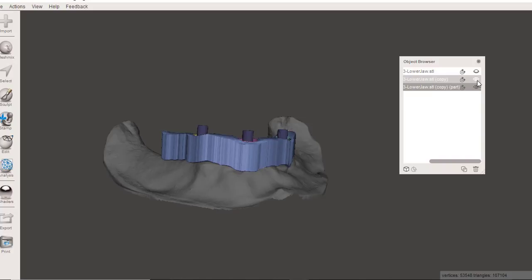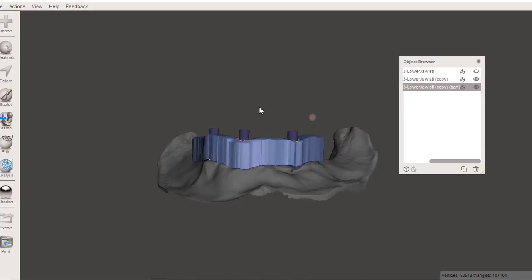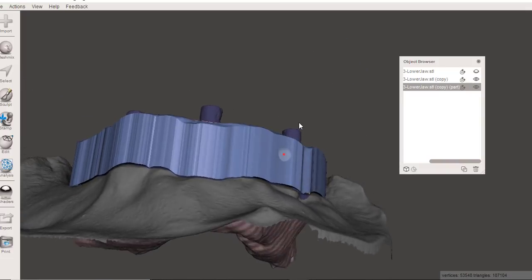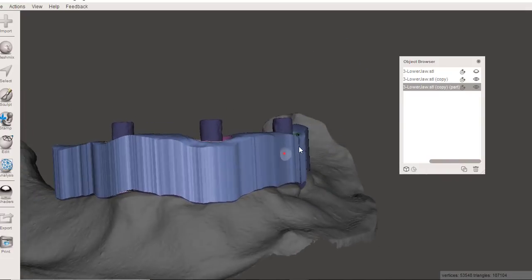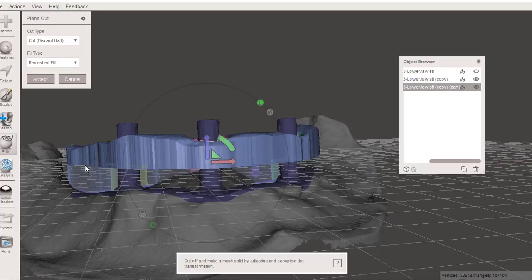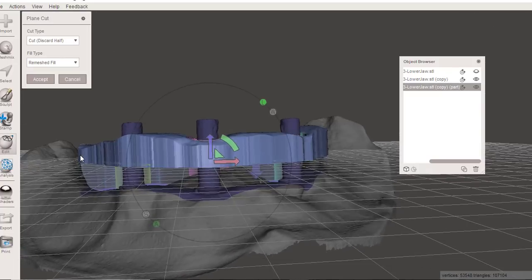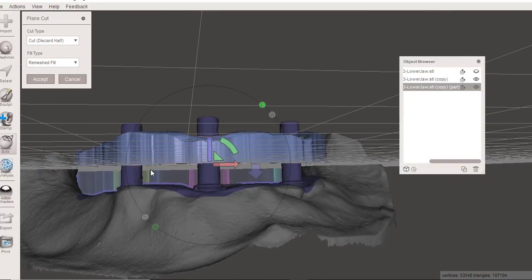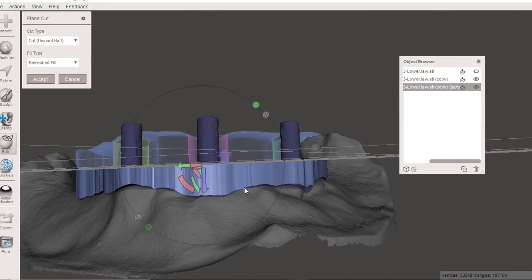And the last thing we would need to do is make a plane cut on this. All right, so let's orient across here and then go to the edit menu and plane cut this to give a flat surface to our bar. And you don't have the ability to measure while you're using this tool, so I'm just eyeballing it, and I want to be able to make sure that I keep 2 to 3 millimeters of thickness to this bar in all dimensions.